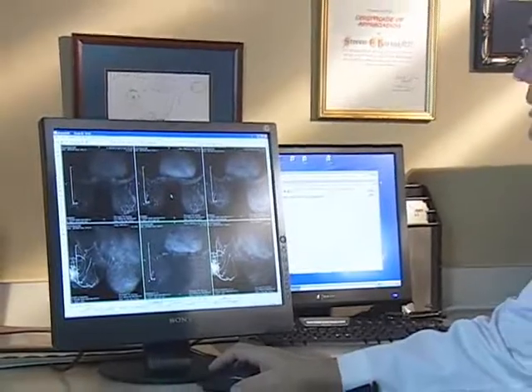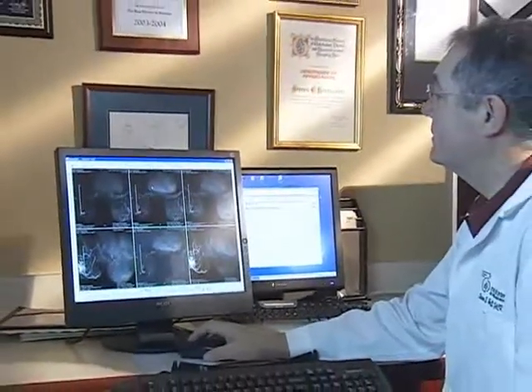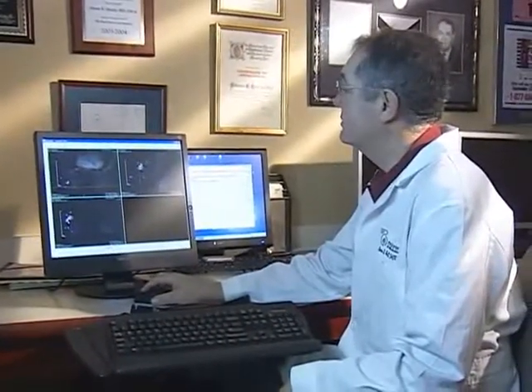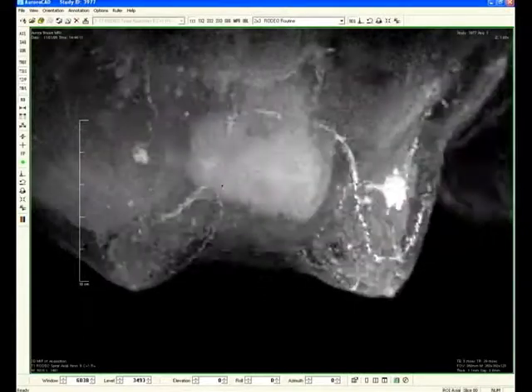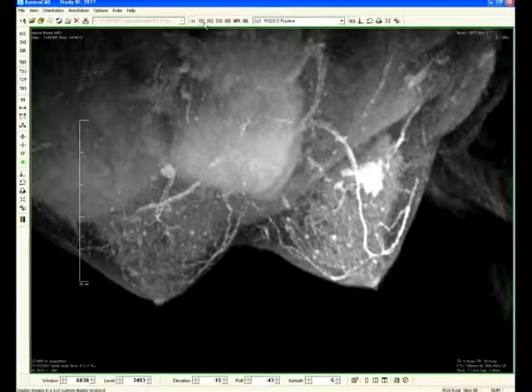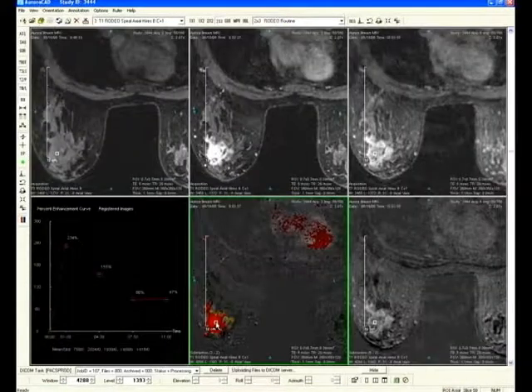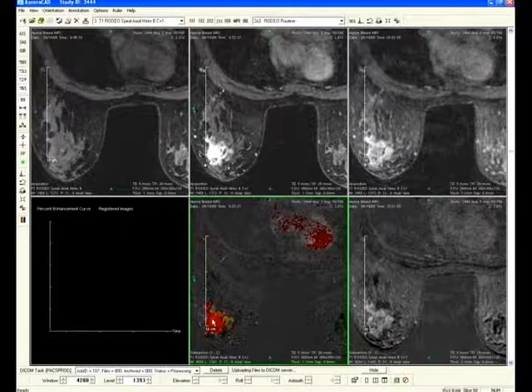The Aurora dedicated breast MRI is designed to be the complete solution for breast MRI diagnosis. One major component of this system is the system for image analysis called AuroraCAD. Breast MRI systems are capable of generating large numbers of images that can be further processed into even larger numbers of images. However, making lots of images for the radiologist to interpret is not the objective. The goal is to provide information that can assist the radiologist in efficiently rendering accurate interpretations.